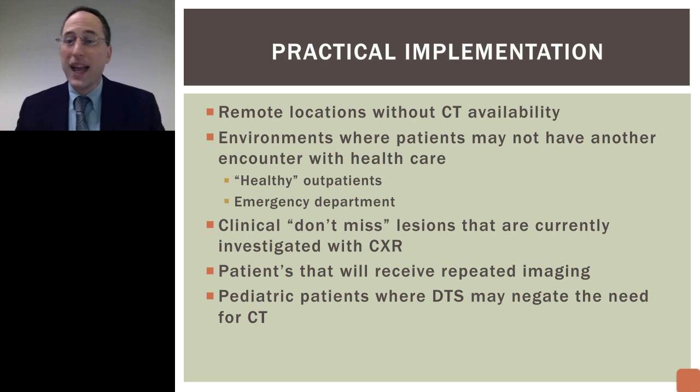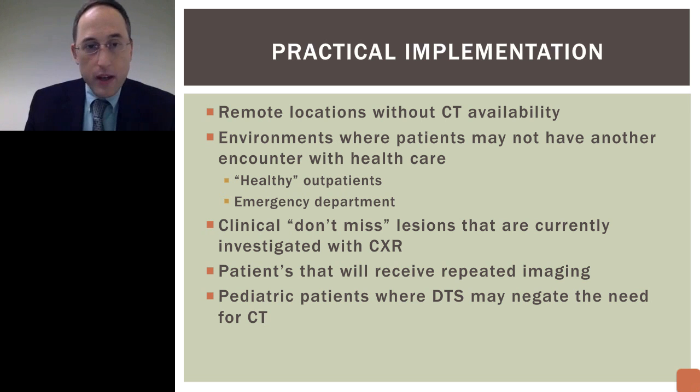And then, of course, pediatric patients where radiation really is a concern, where if they have an unclear chest X-ray, instead of sending them to CT, you do a tomo first. Okay? All right.